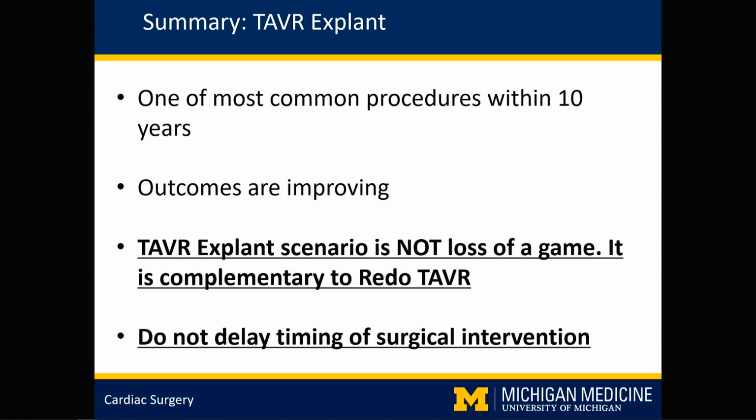I believe, as I mentioned, it's because people are so reluctant to go through the explant process, and that's what's hurting the outcomes. So as a society, we should share our experience with the cardiology doctors and vice versa. I think the valve reintervention strategy is all complementary: TAVR explant, redo TAVR. We should offer what's best for each patient.